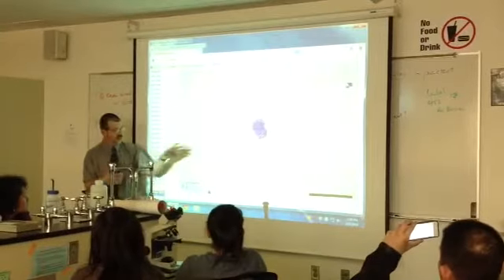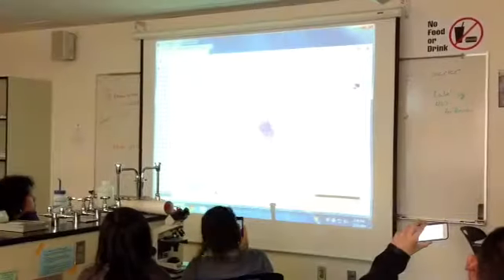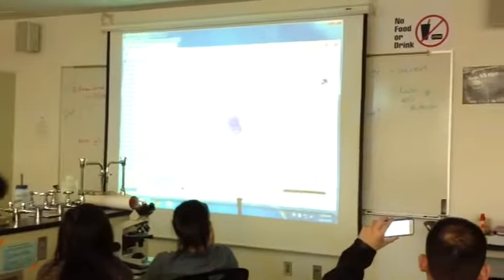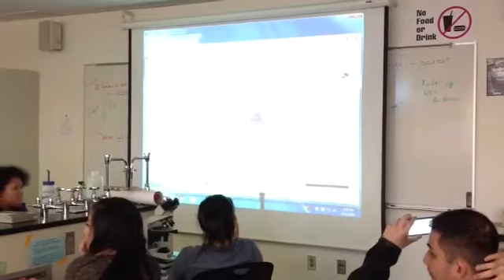So personally, these ones are always hard because they vary a lot more than the other ones do. They look for size, along with nucleus, along with no speckles, along with cytoplasm size. That's a monocyte. So it fills up less of the cytoplasm than the lymphocyte.